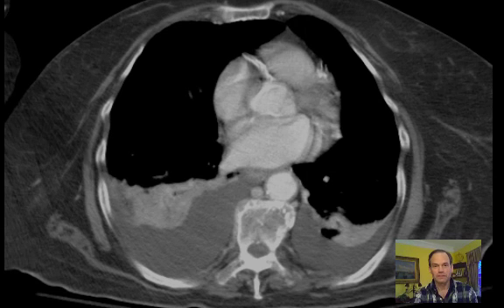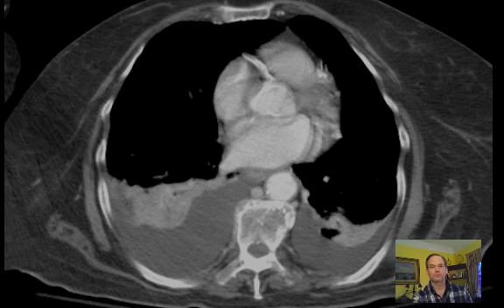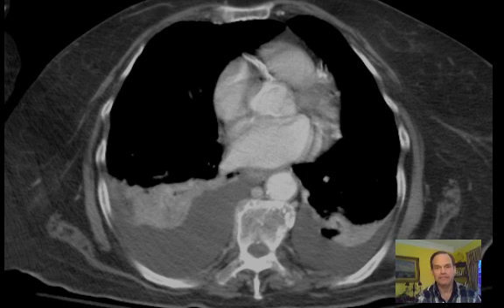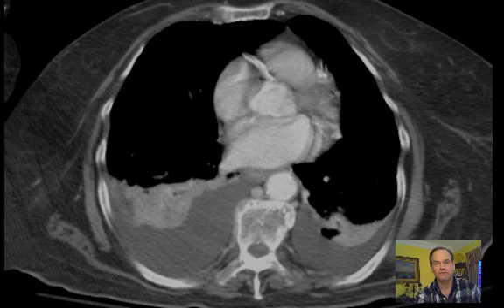Hello, Dr. Mintz here. I wanted to go through a somewhat interesting case of CT abdomen and pelvis, mainly to go through some of the anatomy here.